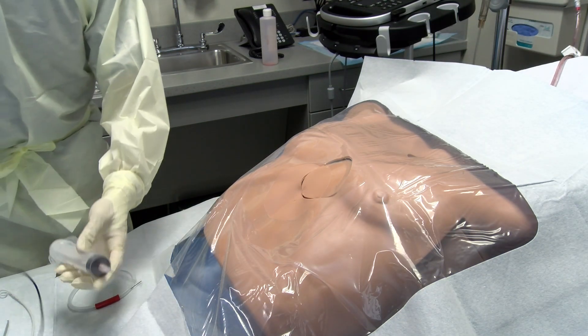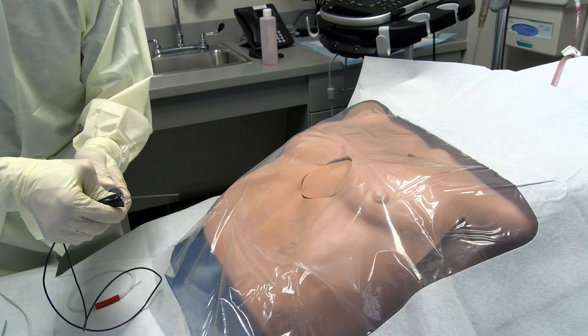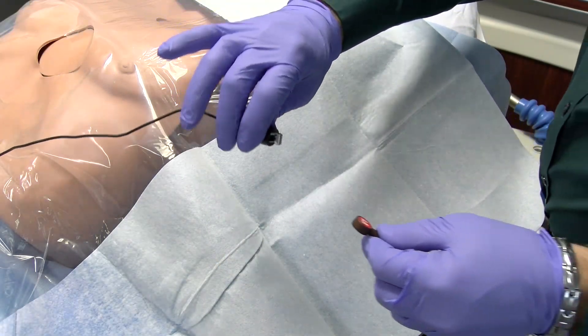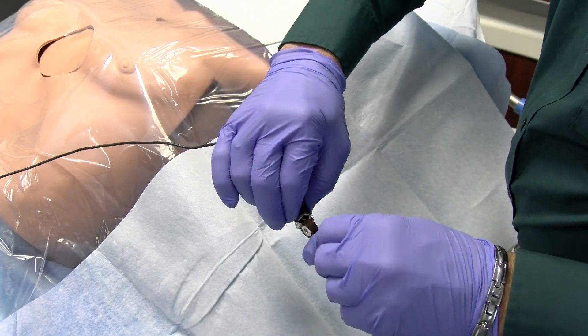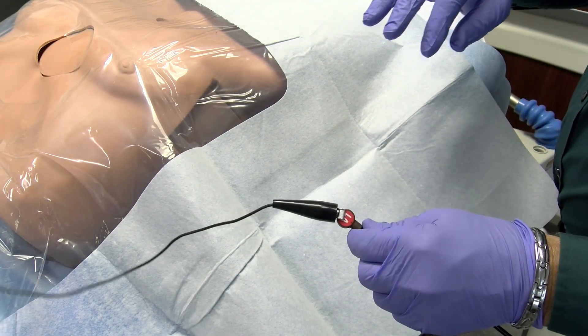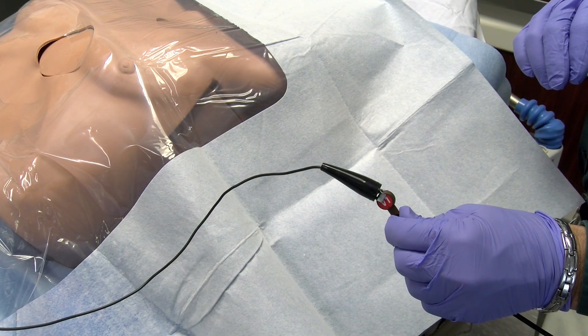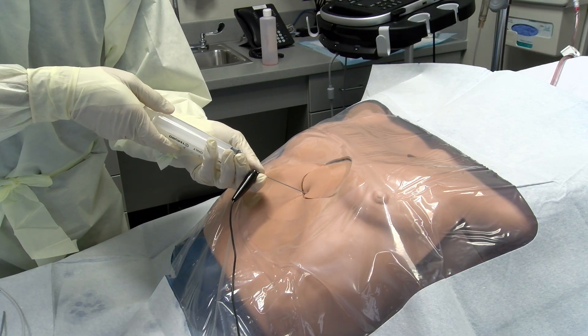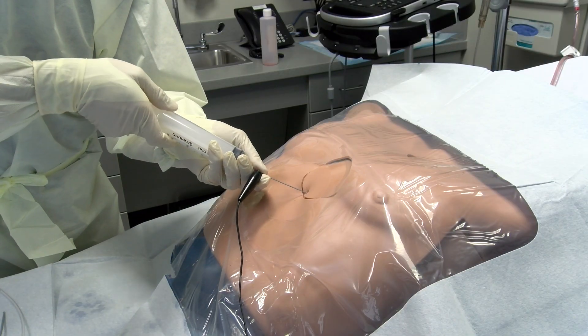Once the track has been anesthetized, attach the precordial leads — either V1 or V2 — from the patient's EKG to the needle hub using a sterile alligator clip. The needle can then be inserted along the previously anesthetized track under negative pressure until fluid is returned.